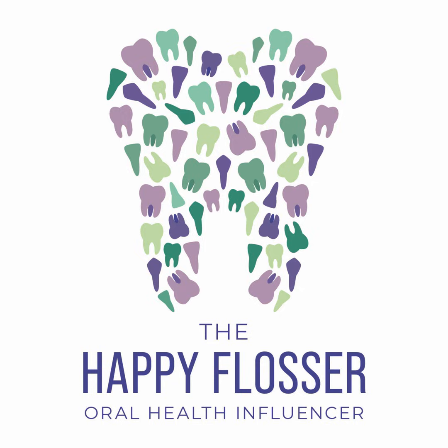The mandibular molar positioning for the image is ideal to capture all the molars on the image. You want to place the sensor so that the central ray is centered on that mandibular second molar. And just like with the maxillary posterior image, if the third molar is present, line up that central ray on the embrasure space between the second and third molar. You may get some overlap as well, but you can make the necessary adjustments on the premolar shot if you need to. The most important thing is to capture the apices of all of the teeth. Now let's move on to the bite wings.